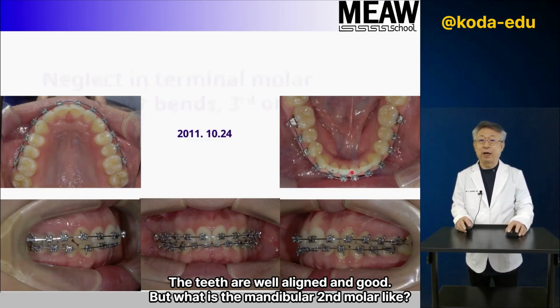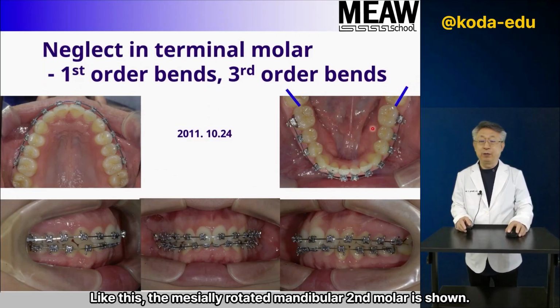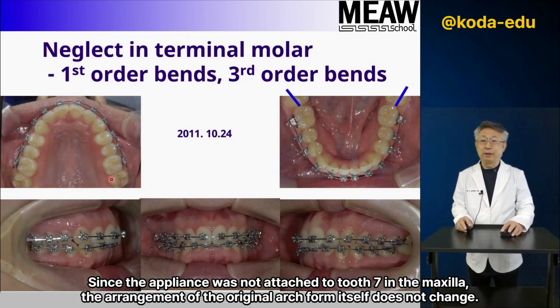But what is the mandibular second molar like? Like this, the mesially rotated mandibular second molar is shown. It would be the same in the maxilla by attaching the appliance to the tooth 7. Since the appliance was not attached to tooth 7 in the maxilla, the arrangement of the original arch form itself does not change.